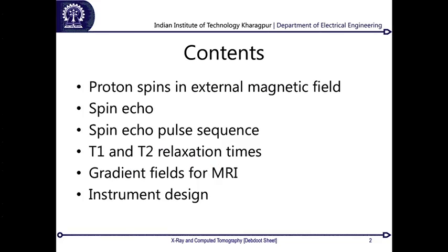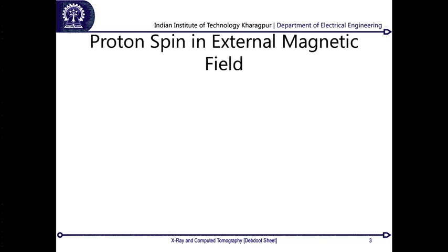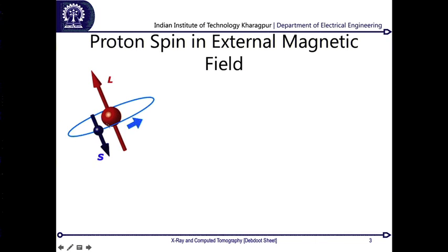So without delaying much, let's enter into what I wanted to say here. See that whenever you have an electron rotating around a nucleus, so you basically have a nucleus and an electron which is spinning around it at a very fast rate. Now if you look at the total atom together, it also needs to be in equilibrium. So the angular momentum caused by this spinning electron has to be somehow compensated by the nucleus spinning in the opposite direction as well.